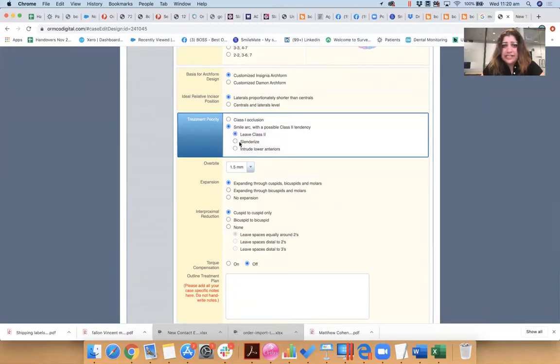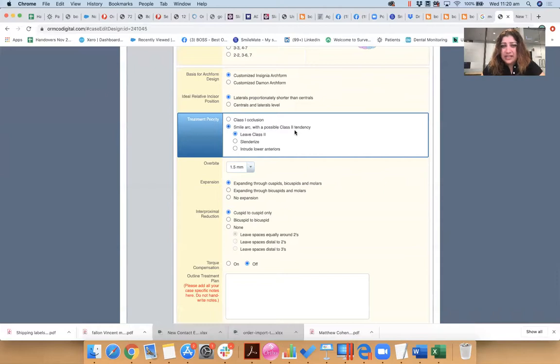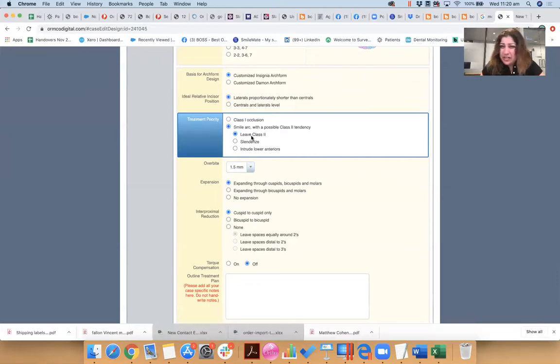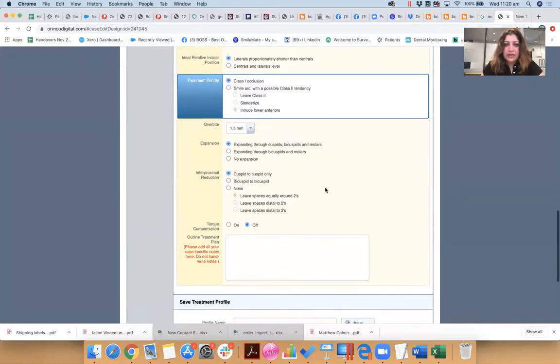Where you might want to create a possible Class II tendency but actually leave a tiny bit of Class II or intrude lower anterior. So we're going to go for Class I here for now.